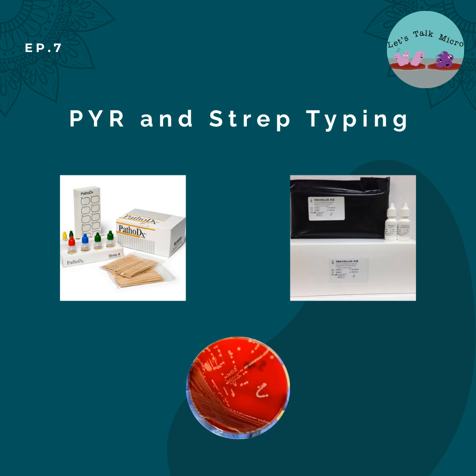If you don't have those, you don't have that many colonies, sub it to a blood plate, because you might be surprised the next day. You have those beta hemolytic colonies on PEA, you sub it to blood, then the next day you're like, oh, this is gamma hemolytic, PYR positive, okay. Then there's no need to do the typing, because at that point in time, it's gamma hemolytic, PYR positive, what do you have? Enterococcus. So just be careful out there.